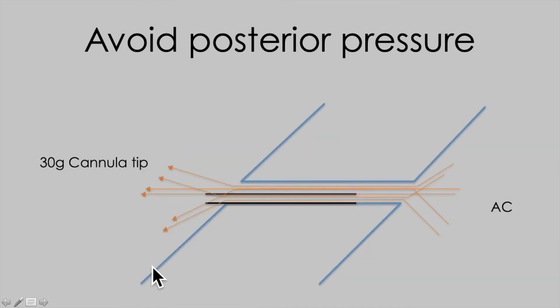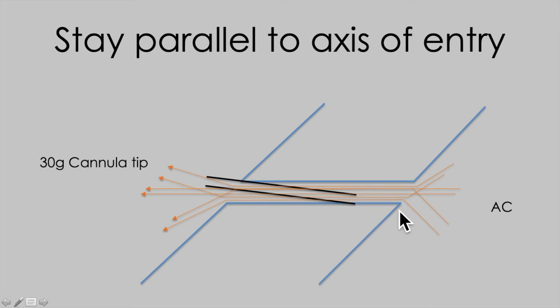A couple of beginner's errors: try and avoid posterior pressure when you're advancing the cannula, as this splints the entry site open and allows uncontrolled flow around the cannula. Similarly, if you're entering at the wrong angle, you're going to be levering the paracentesis open and again allowing uncontrolled flow.